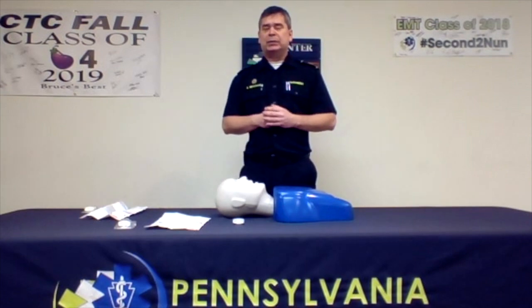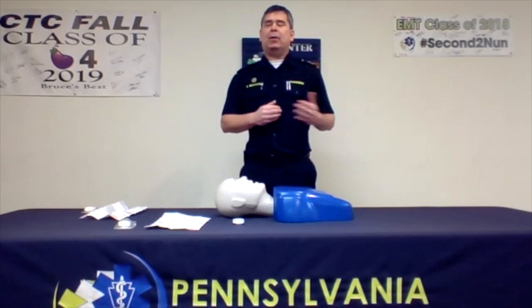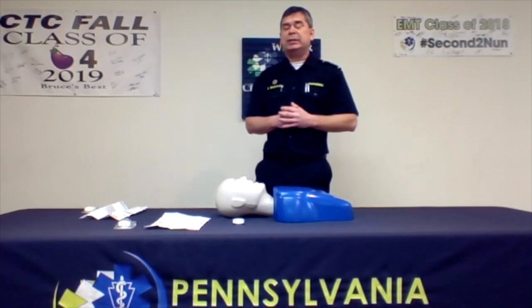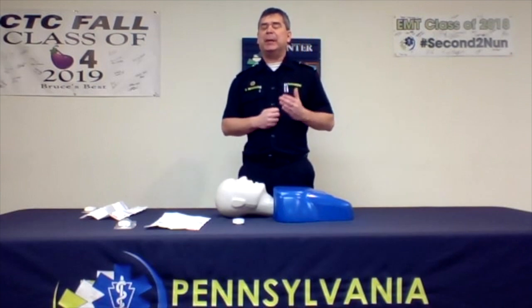It's important to understand that nasal Narcan is not to be given without calling 911. It's important that 911 and emergency services are contacted because repeated doses of Narcan may be required for the opioid overdose.